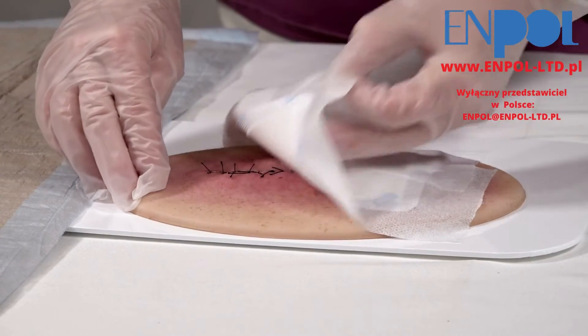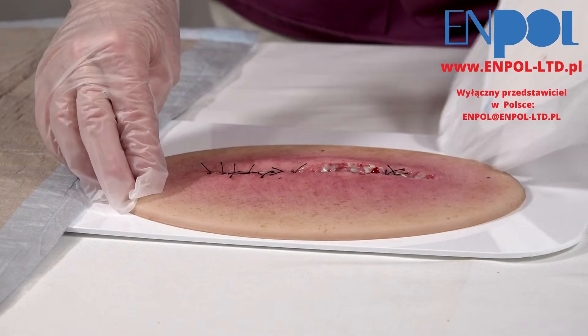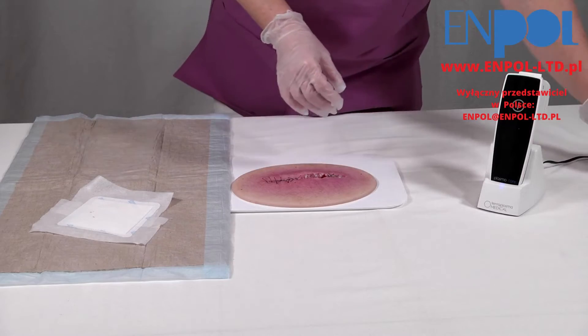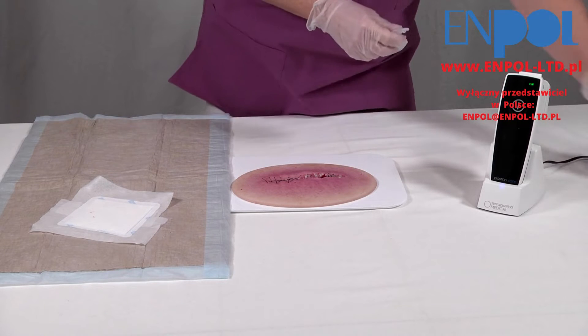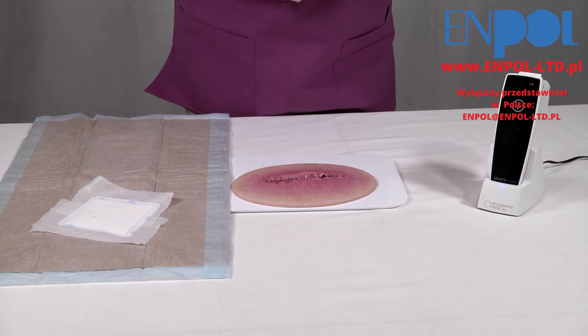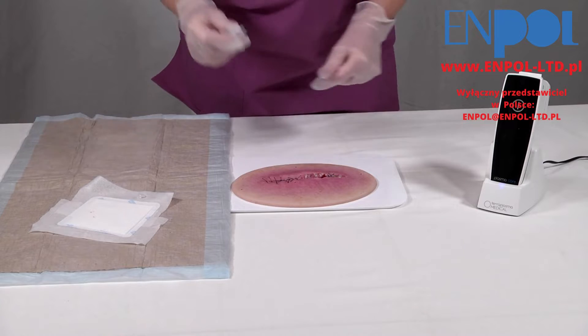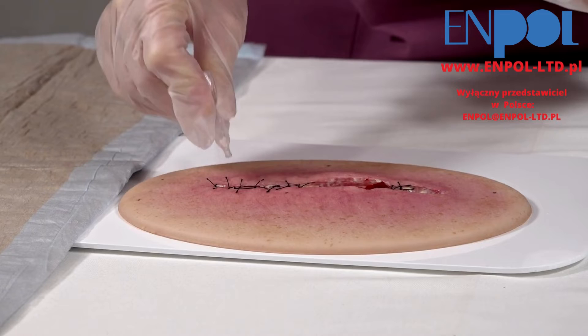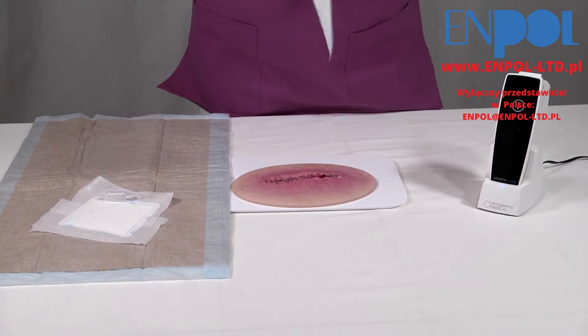Remove the wound dressing. Prior to every treatment with PlasmaCare, a mechanical debridement of the wound is indispensable. Avital tissue and plaques should be removed.